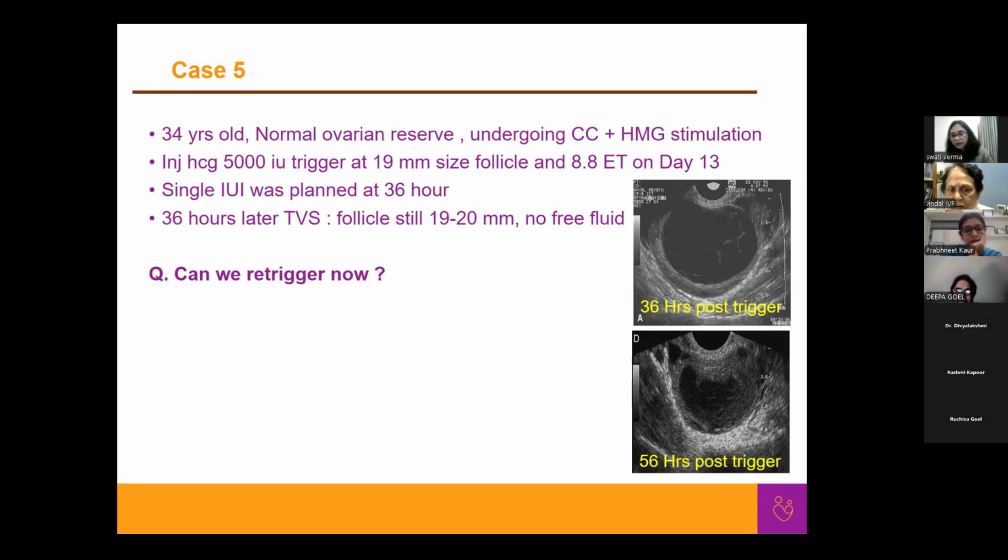Many times you develop an eye; we have always worked with black and white only from the very beginning, so I think black and white also gives a fairly good idea. Exactly, ma'am. The key to using Doppler is that you should have a very good grayscale ultrasound machine. Only there can you put the color. If your black and white focus is not good, then you cannot get a good color either, despite the follicles having good colors.